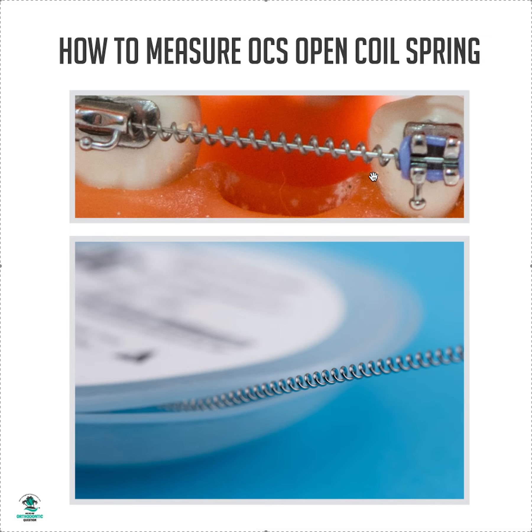When they come back again, if you need more space, you're either going to measure a new unit plus a few more millimeters, or you can use crimpable stops — but those only work on rectangular wires. A crimpable stop is only going to move in one direction depending on where you put it, so check out my content on crimpable stops, or search OCS and it should come up. Thanks so much.